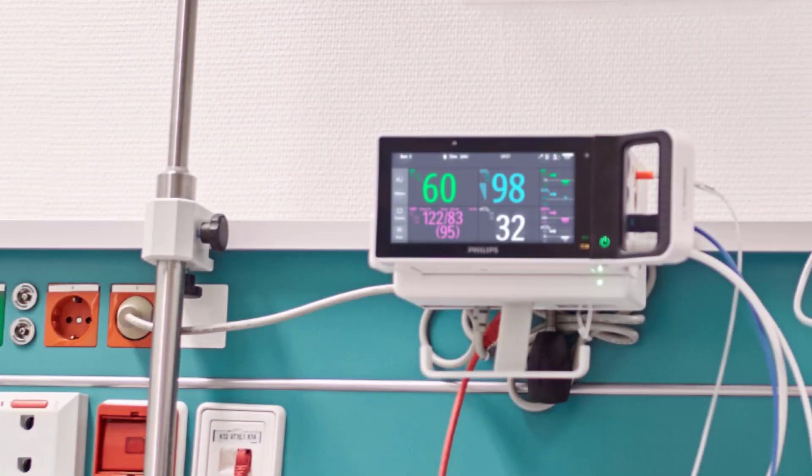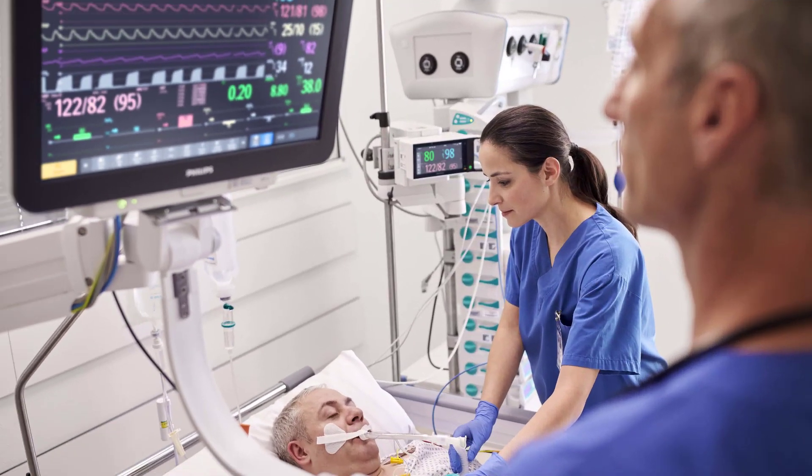The X3 can be used in two ways: as a standalone patient monitor, or as a multi-measurement module for the Intelliview family of patient monitors.